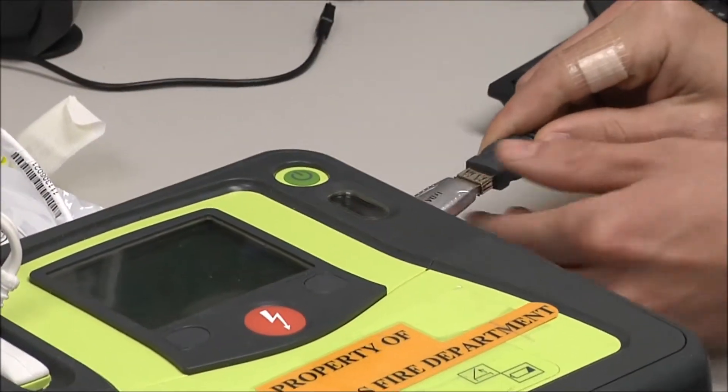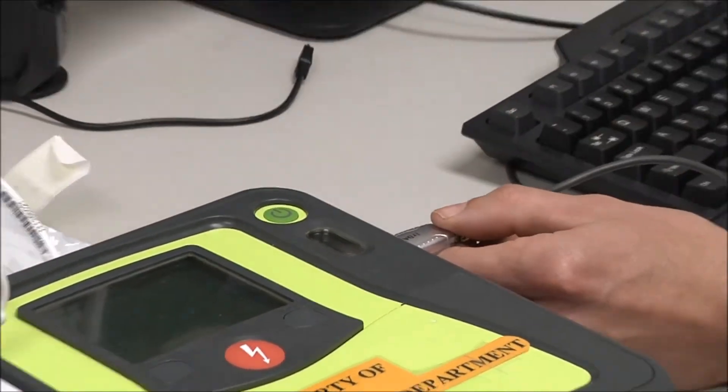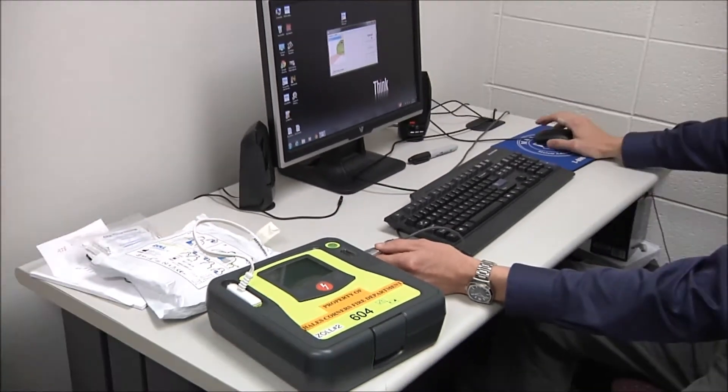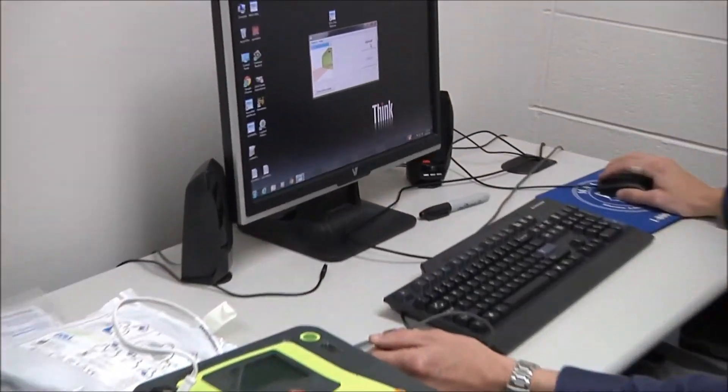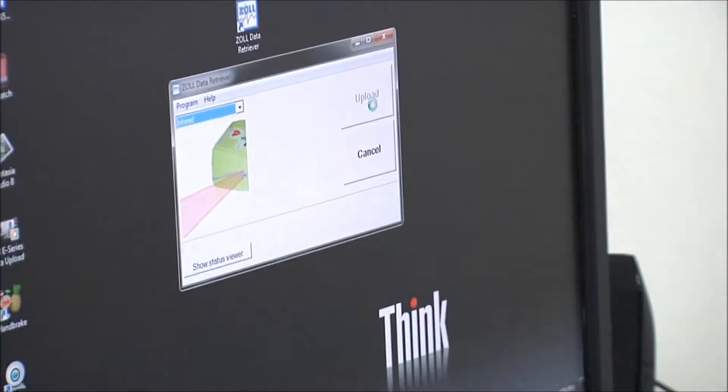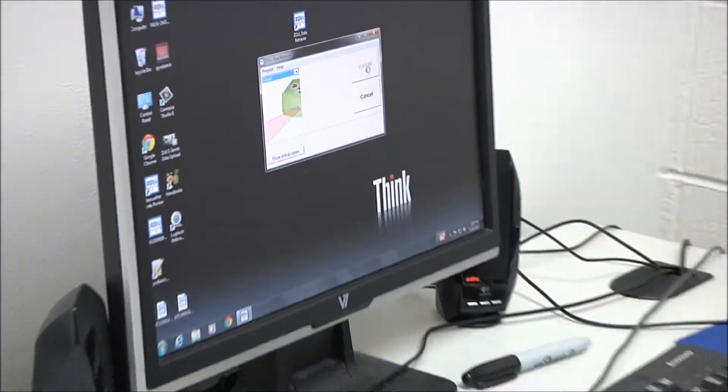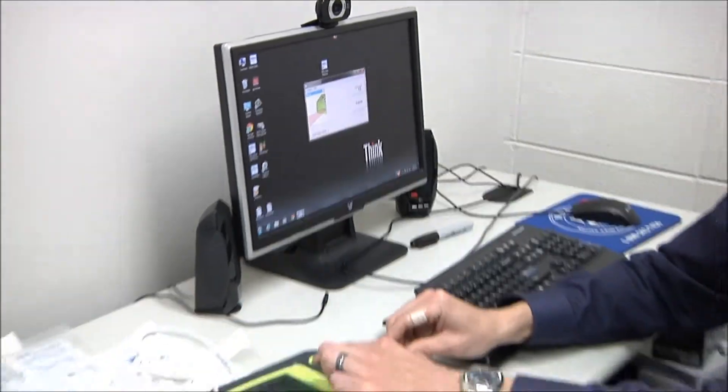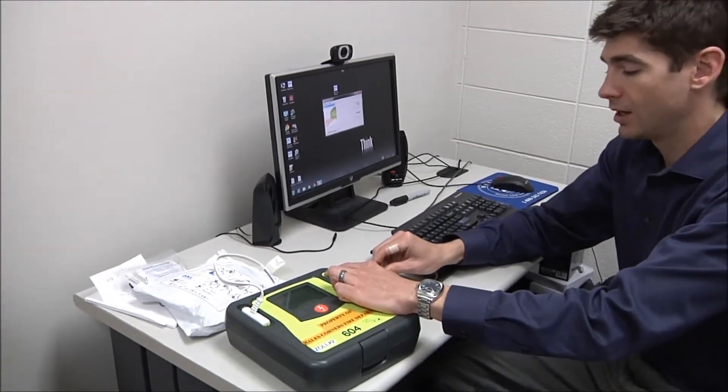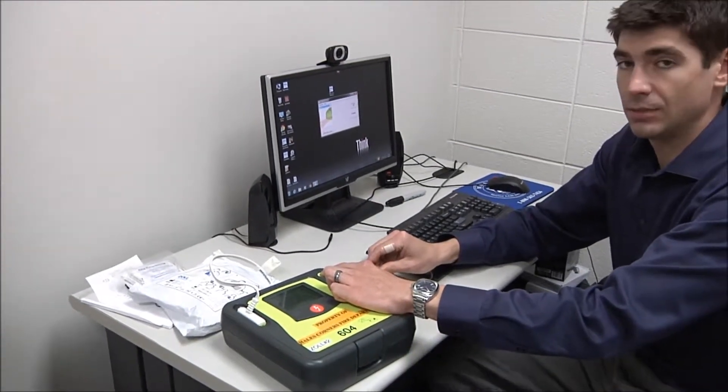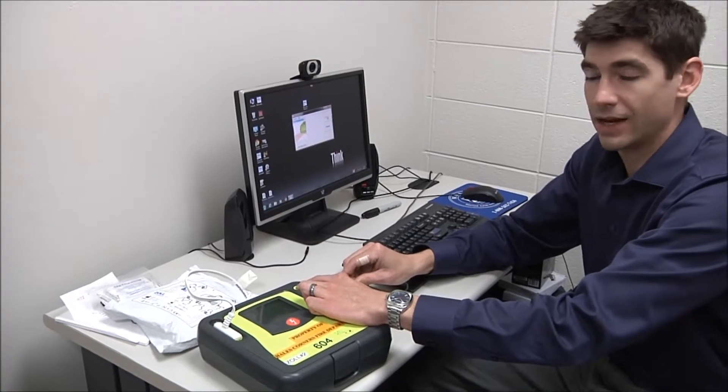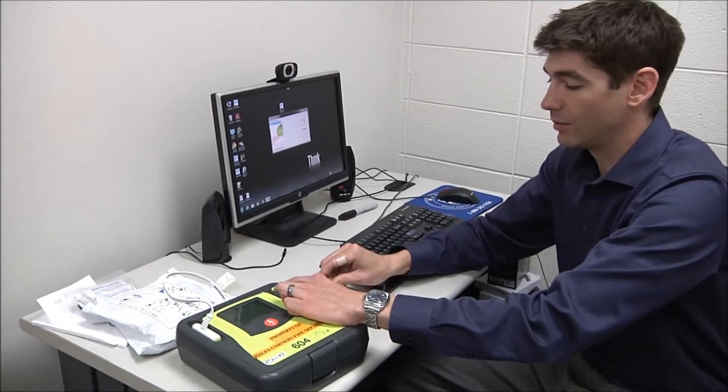So holding that onto the side, I'm going to click the upload button on the screen here and then I'm going to hold down the power button on the AED Pro until it says communications have been established. And then I can release the power button.